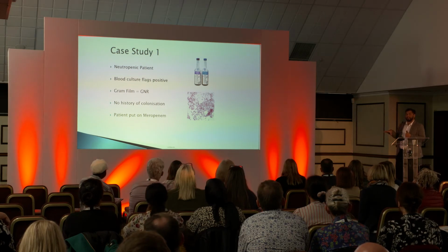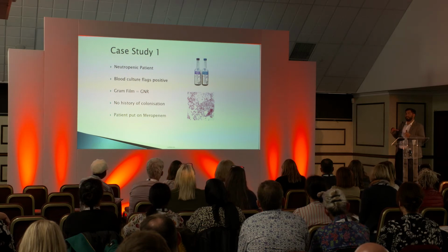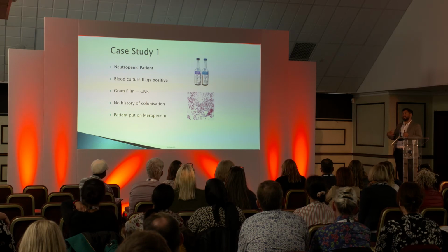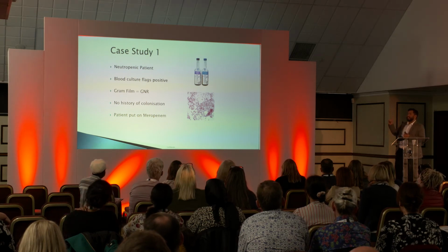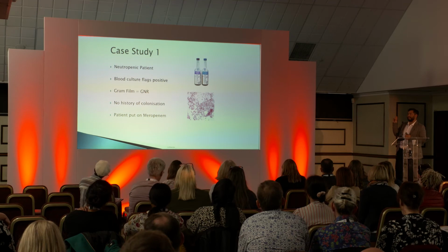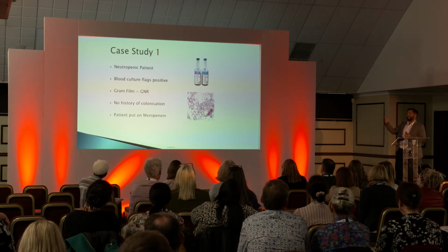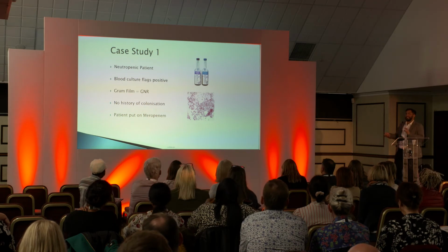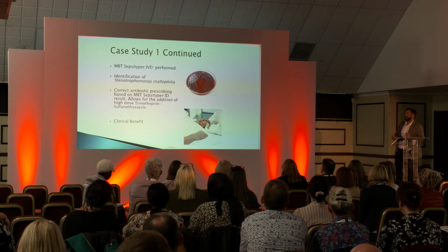Looking at the patient history, there's not actually any record of colonization, because we do a lot of screening for our neutropenic patients. Because they're more septic, we like to know what they're carrying, because again, they can get septic more quickly. So just having the information that it's a Gram-negative rod, what pharmacy would do is prescribe the patient meropenem. So now, let's go to using the Sepsityper.